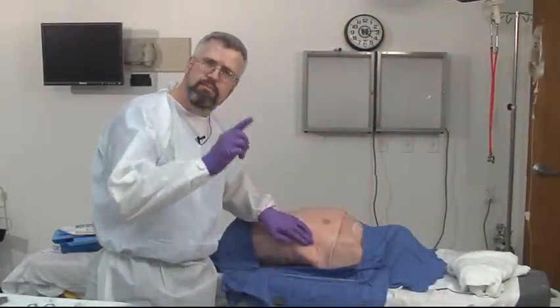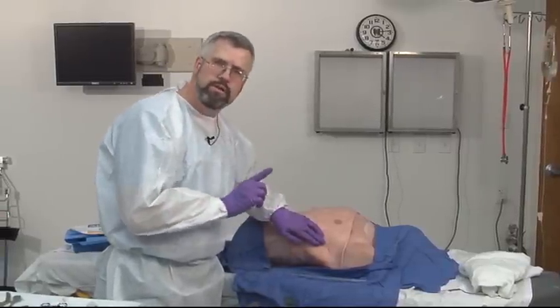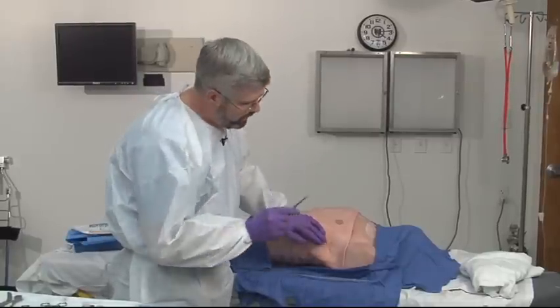The other key point here is you want to go on top of the rib, not under the rib, because the neurovascular bundle is under the rib and you'll cause intercostal bleeding if you do that. The other key here is to use a large clamp.